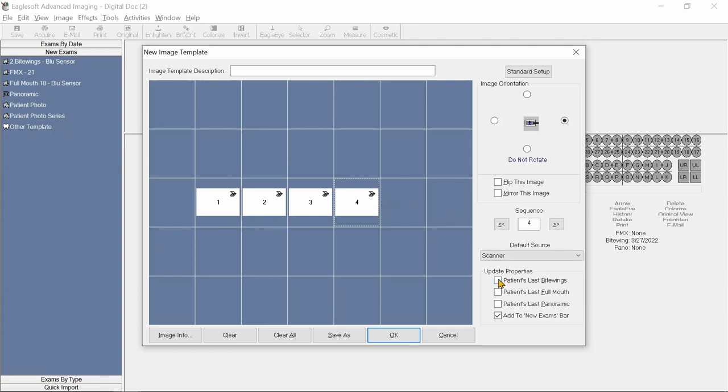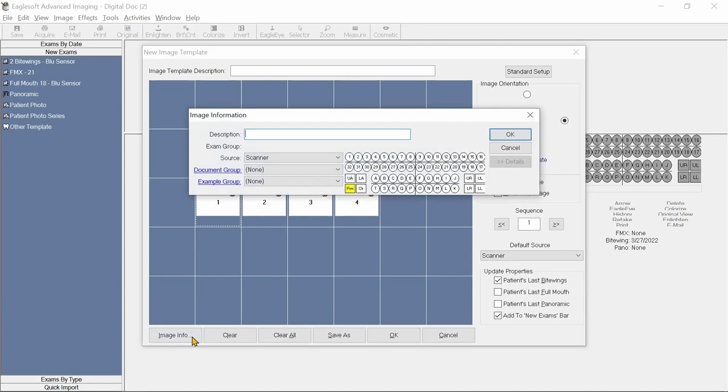Within EagleSoft, we will uncheck Flip and Mirror and ensure that EagleSoft is not rotating the images, as that will be managed by the driver.